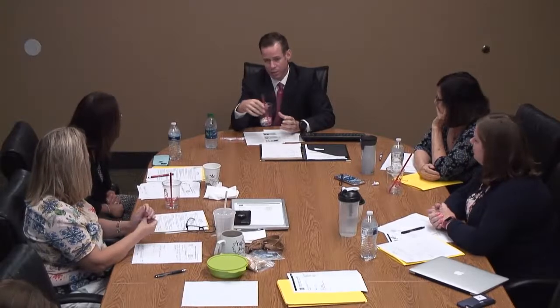So this is the way I like to think of, at its most basic function, a chest tube. And you'll see when we get into the real life applications in the nursing realm what's going on. If you think of it, we created a positive pressure environment in the chest, and we can't have that air in the chest, so we have to get it out, and we don't want it to come back in. So if you put the tube into the side of the chest and the air starts to come out, it's going to blow into the cup, like everyone can blow into their cup. And you'll see that the air can go out. It's going to rise out through the water, and there's no possible way for the air to come back into the lungs, right?